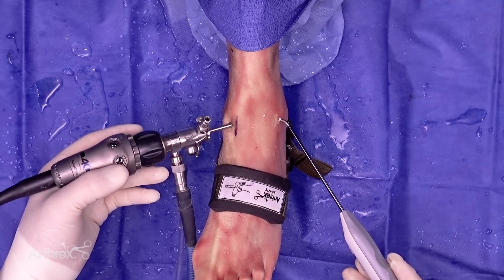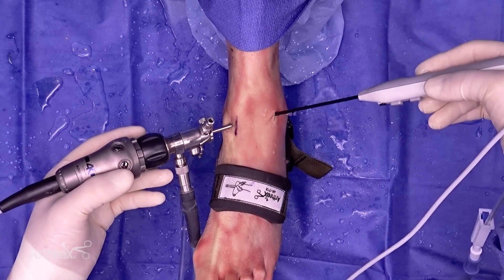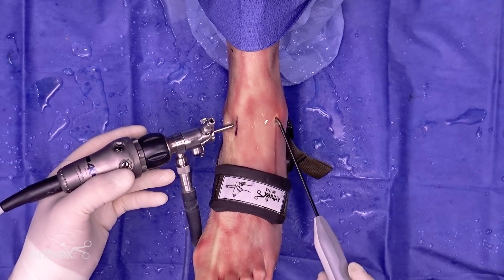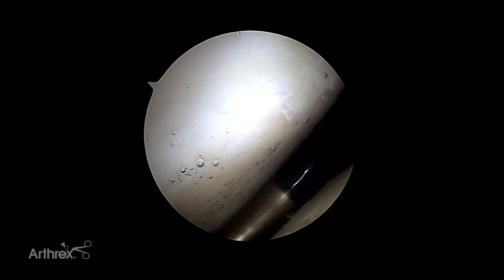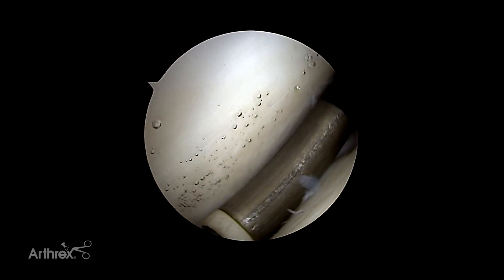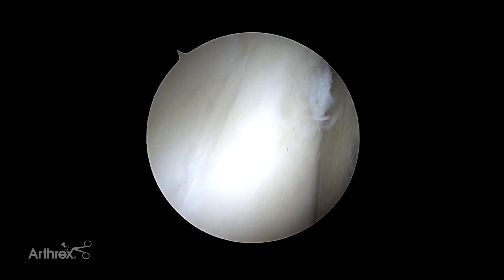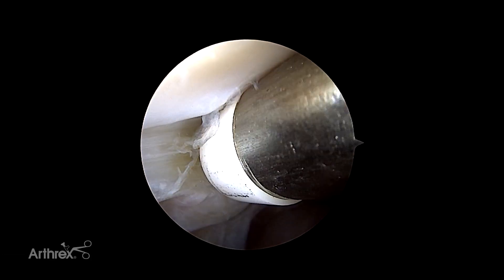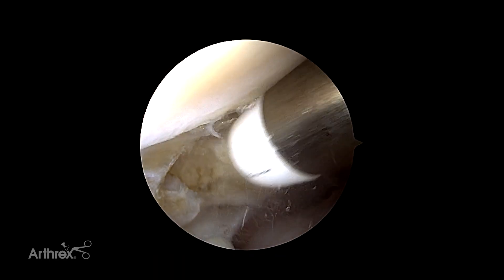Some key tricks to remember: First, when inserting, always put the probe in so the tip goes in first at 90 degrees — rotate your hand after entry, don't try to go straight in, or you'll need huge incisions. Keep your incision small, get into just the edge of the capsule, then rotate. Second, respect the curve — when going back into the posterior ankle, keep it turned at 90 degrees until it passes the talus, then rotate. That's the SJ50 probe. It has the coag function, works great for osteochondral lesions, ablates within seconds, saves you a lot of time, and has all the functions you could possibly need.